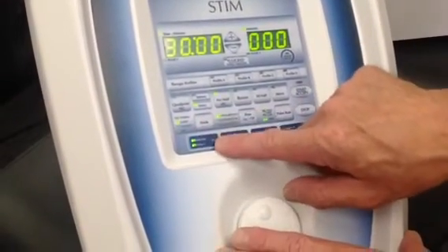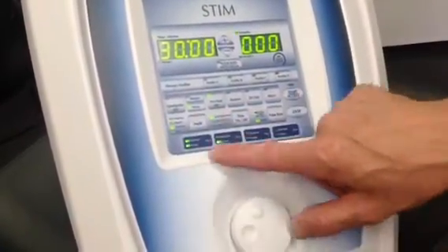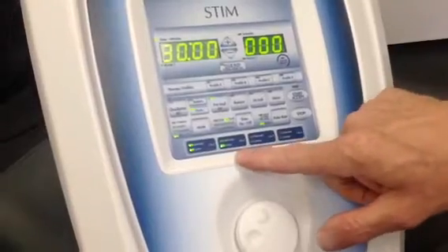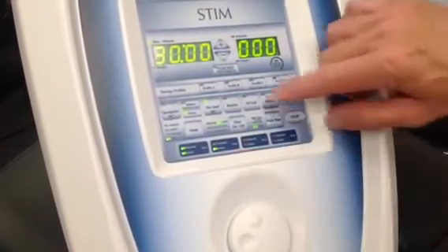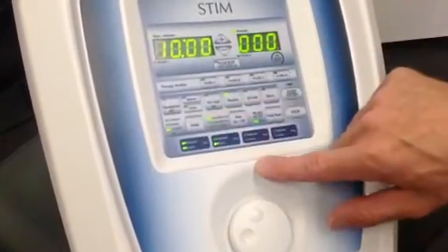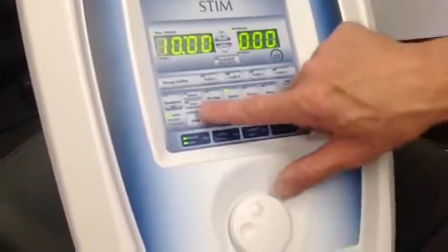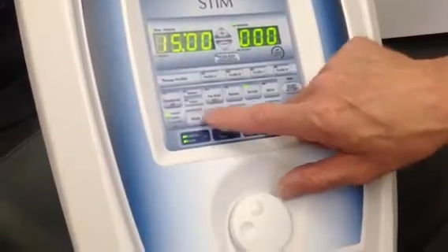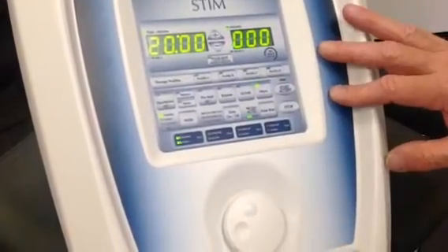Although on this machine, when you go over here to your mode, of course, normal and surge, then when you do co-contract, it grabbed both channels. And then if you do alternating, it will also do both channels. So in your pre-mod, you can do a single channel or 2-channel application. All right, Russian stim is the same way. So it automatically goes into surge, but if you want to do co-contract, it's going to do a 2-channel application, or alternating is also 2-channel. If we go back to normal or surge, it's just a 1-channel application. Okay, the same is true in your high volt. And microcurrents only has a normal application to it.